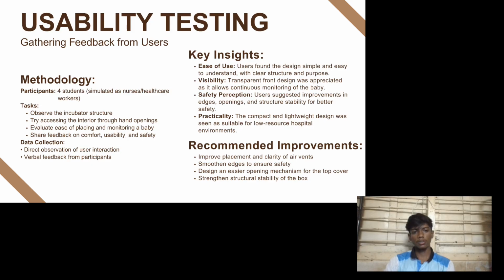Next, data collection. How did we collect the data? We used two methods. The first is direct observation, where we watched how they interacted with the incubator. The second is verbal feedback. They told us their experience and suggestions. Next, we see the key insights.